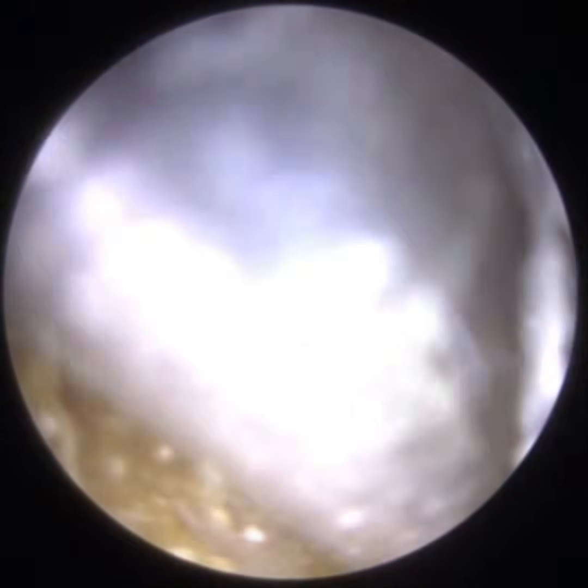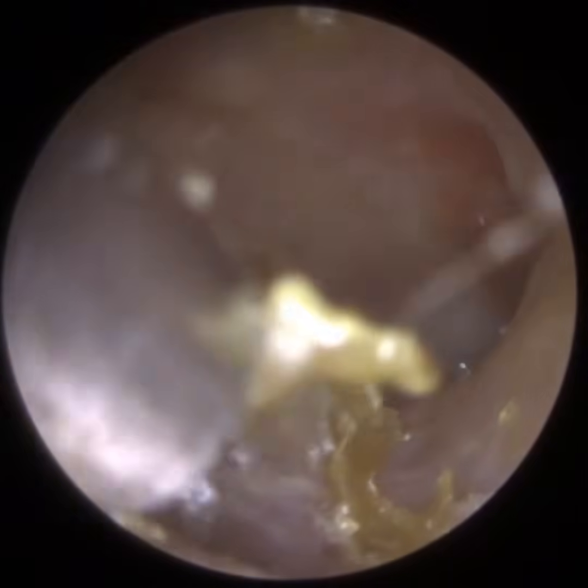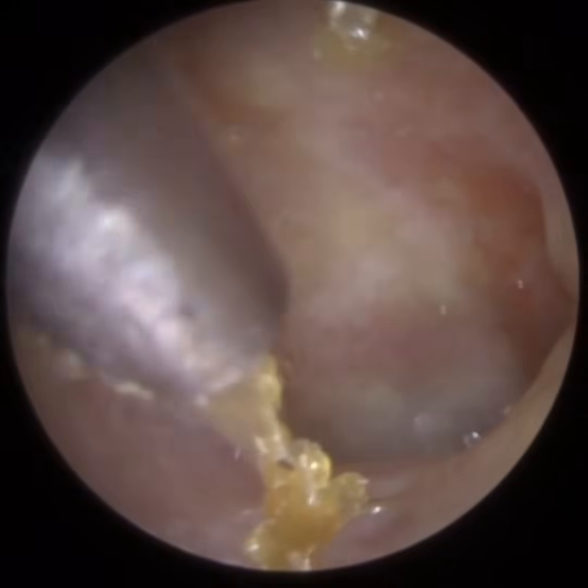And that creates two trenches, two recesses: an inferior recess, a basin near the eardrum, and also one anteriorly, so to the front part of the eardrum, in this case on the left-hand side of the ear. I'll just come back to that in a moment. Again, there's some sticky wet skin on the anterior canal wall. I'm just removing that.